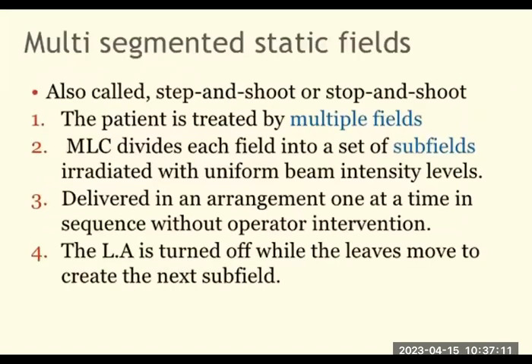The first one is multi-segmented static fields. Here the patient is treated with multiple intensity fields. The complete intensity beam is divided into smaller beams, which you can call subfields. It works in a sequential manner as the gantry moves around the patient. Accordingly, each beam will be divided into subsets. In the first rotation, a set of subfields will be activated.